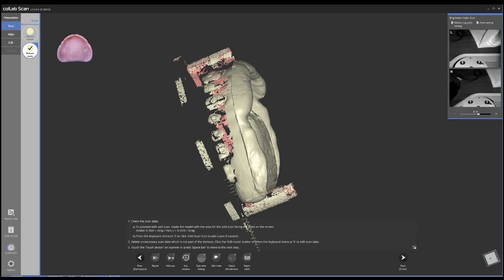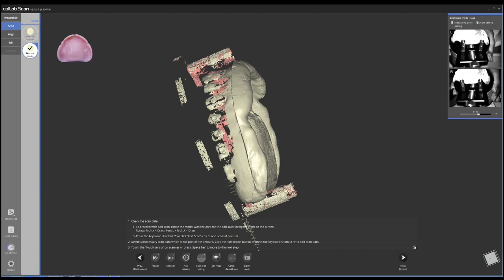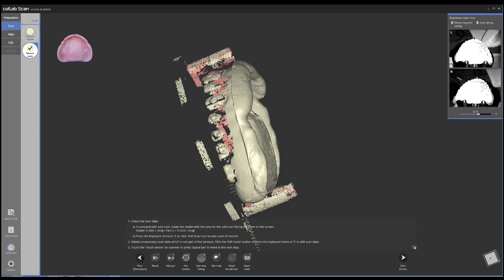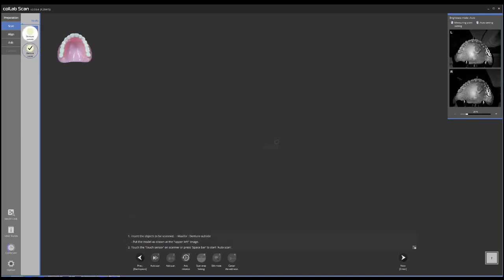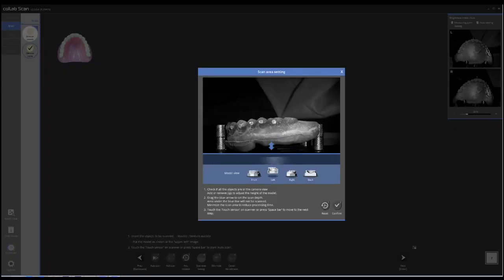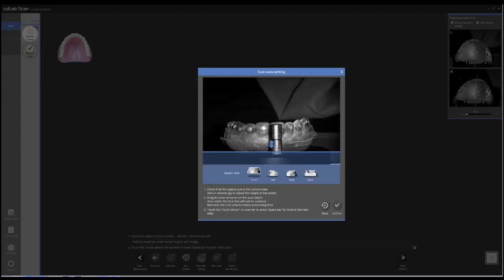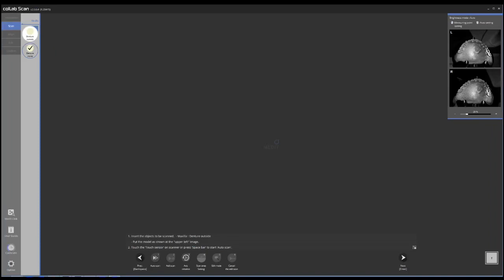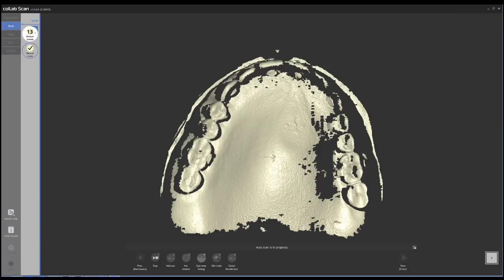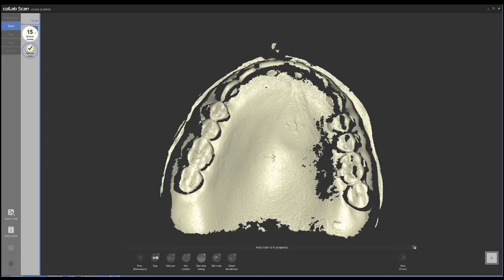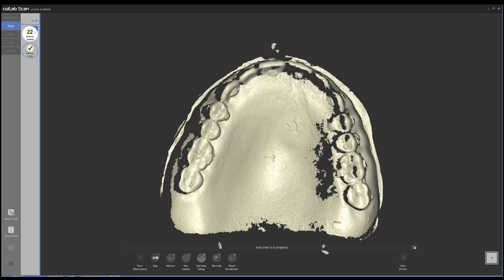Right here I'm changing the position of the denture. Now I'm going to scan the outside part. So I just place the denture, click, crop it as you can see right there, and then one click scan and done.